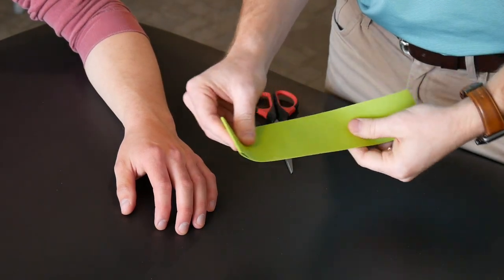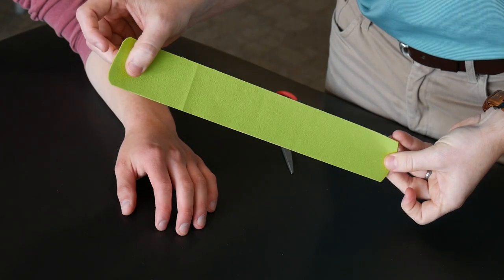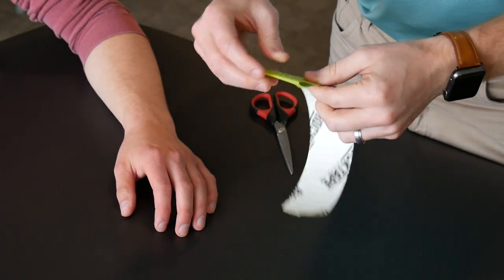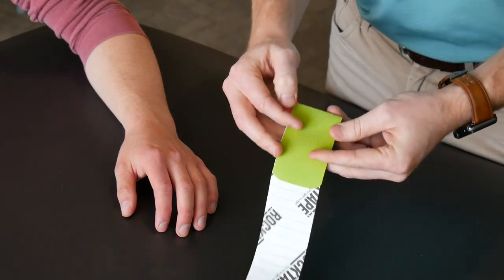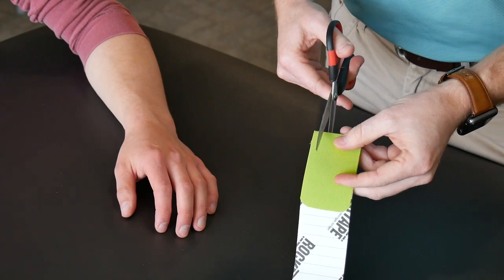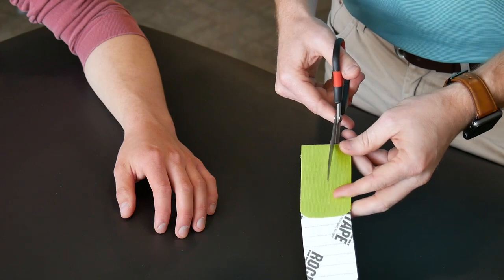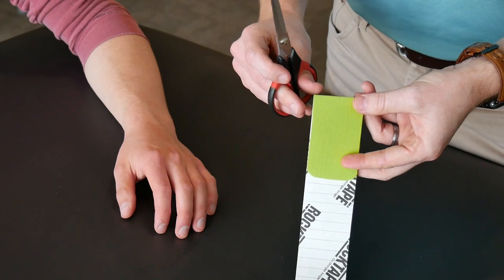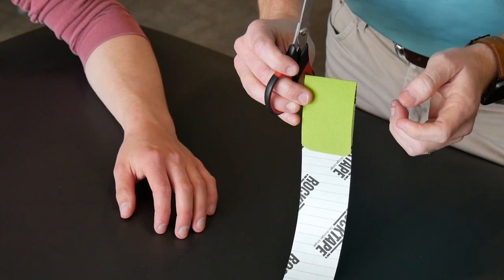So how to cut to apply this tape. We're going to take a piece of tape, two inch tape about this size. We're going to fold one end of it about like this, and we're going to cut small triangles in the edge of the tape. So like I said earlier, if this was for someone in the pediatric population, you could do all four triangles here across the two inch tape. And that one strip of two inch tape could be all you need to tape that baby's hand and wrist into wrist extension.